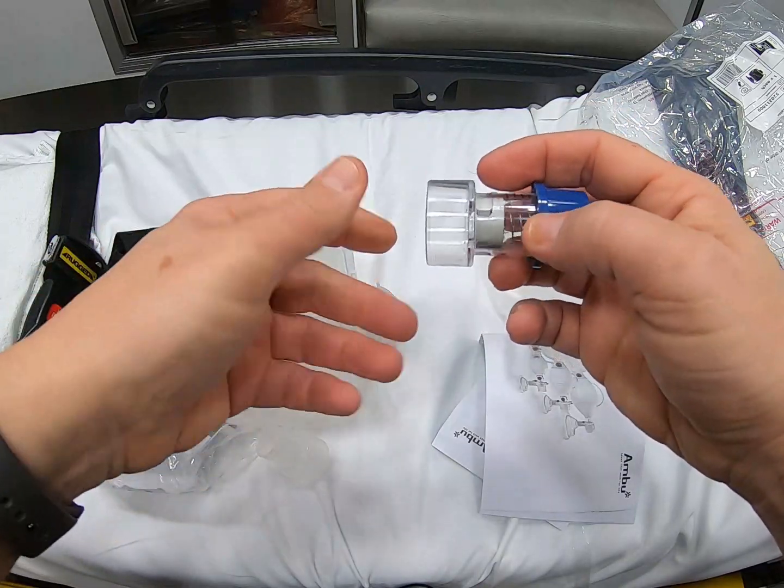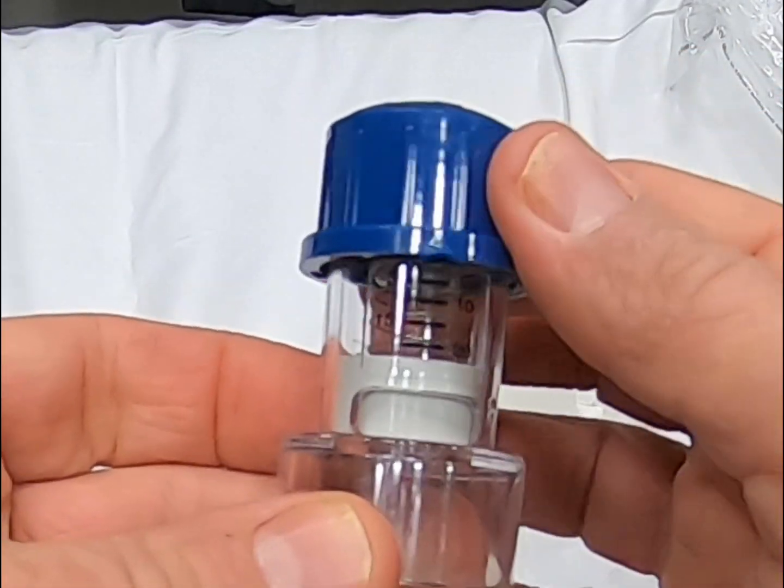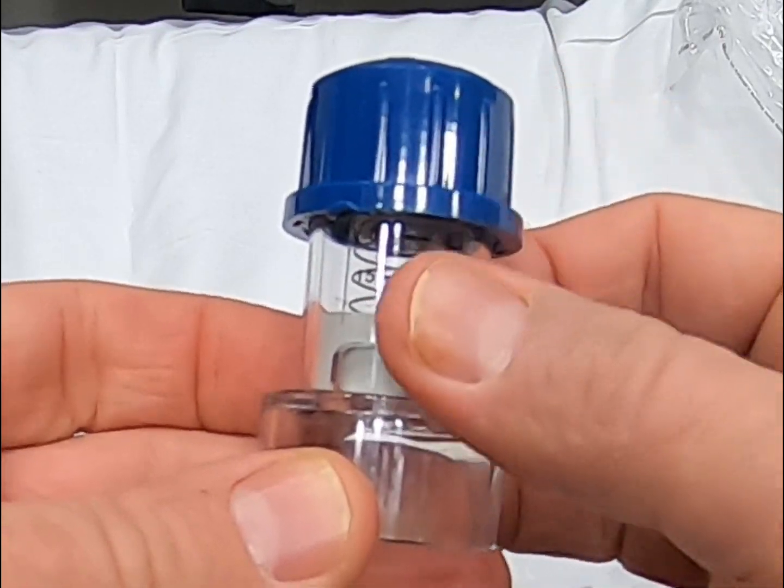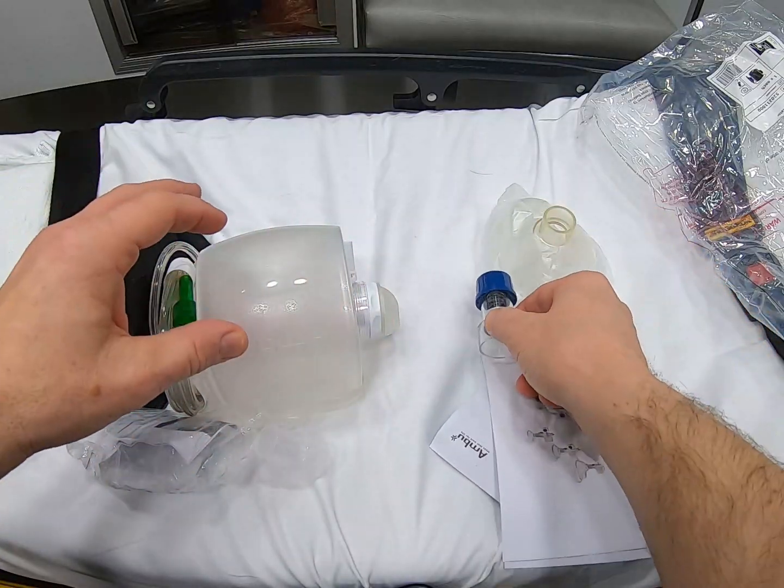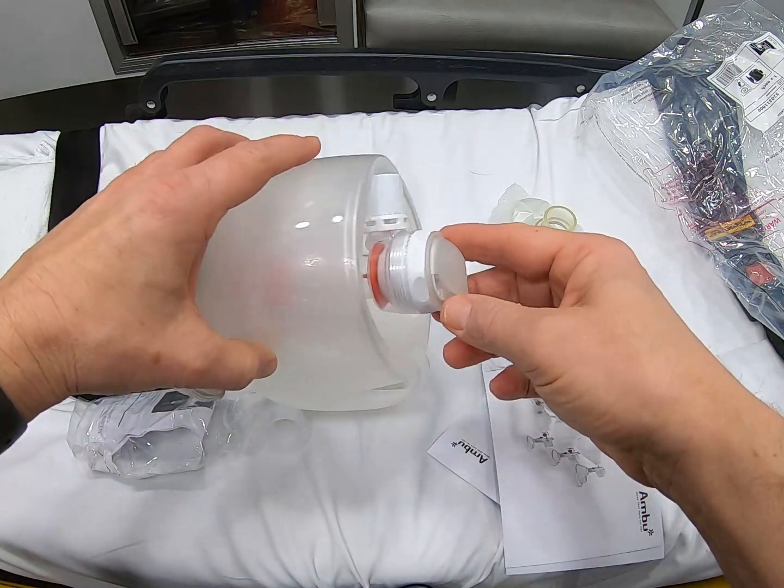You will notice that right in here has the PEEP settings, and this is just twisted. We can set that down and then you have your bag valve, fresh out of the bag.